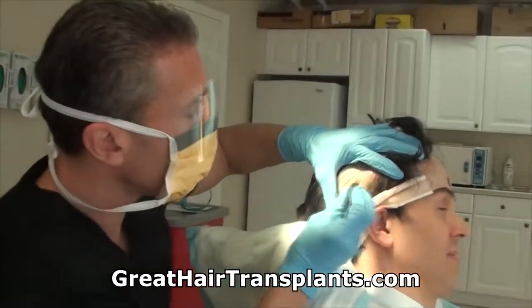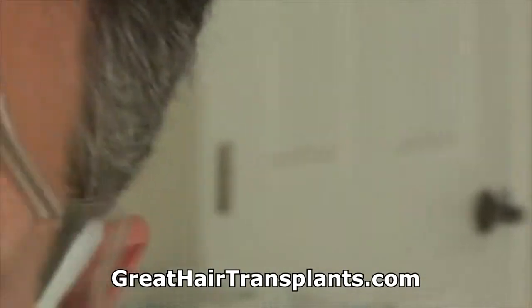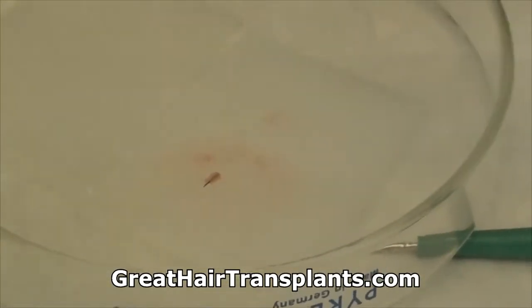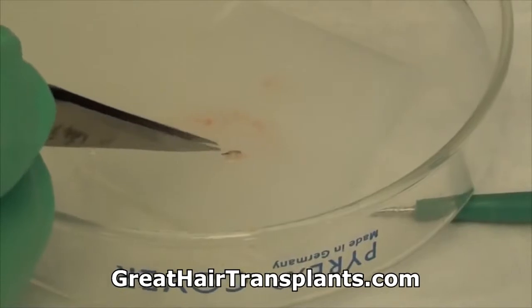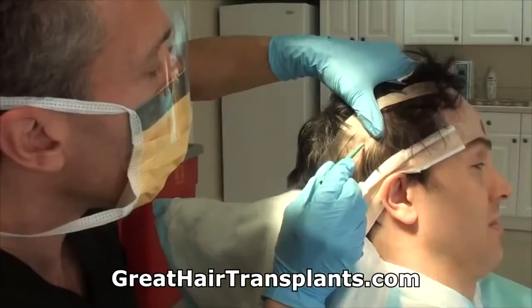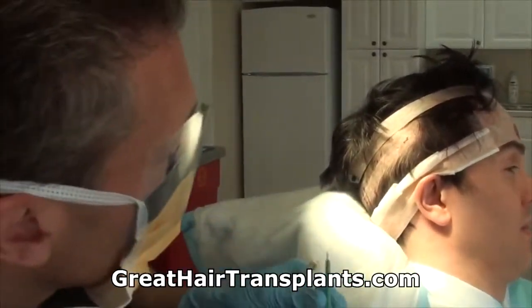Now we're going to take this little bundle. Okay, so that's what we did. So now let's take a look at it. What's happened now on this particular one is the bulb of the follicle has been transected. So we tried to punch that one hair out, and look at where's the bulb? It's non-existent. We cut the bulb off. Okay, so this is part of the general process of what patients go through is they lose hair. Hair changes angles, hair changes directions, hair changes all over the place. So to try to pull out this blindly, okay, now that one just pulled the whole thing out.